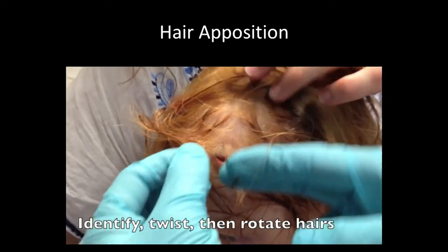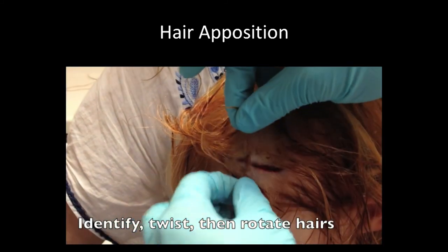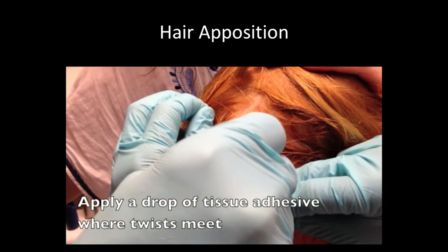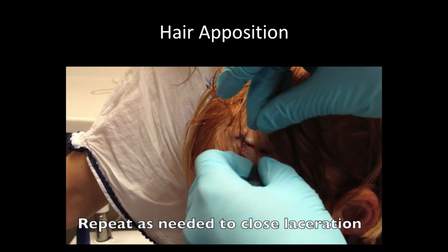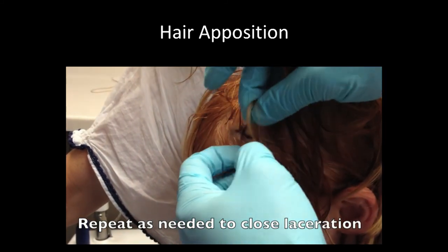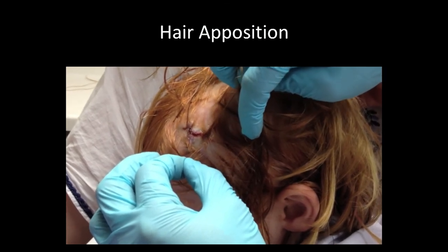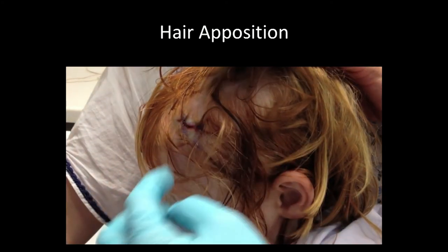After properly cleaning the wound, we took about 5 to 7 strands of hair on either end of the wound, and then we twisted them around in a clockwise circle without tying. We applied just a drop of tissue adhesive where those twists meet, and then held tension there. We then walked down the wound and repeated the process in order to bring those edges together. So as you see, her own hair is acting like embedded sutures within the wound and bringing those edges together. So that's a creative way that you can close a wound without using any sutures. Once the glue dissolves, the hair will naturally unravel, and the patient doesn't need to come back in for a return visit for suture removal unless any complication occurs.